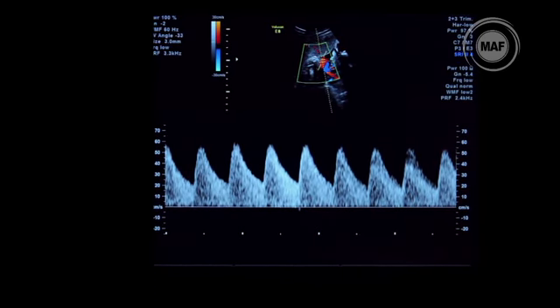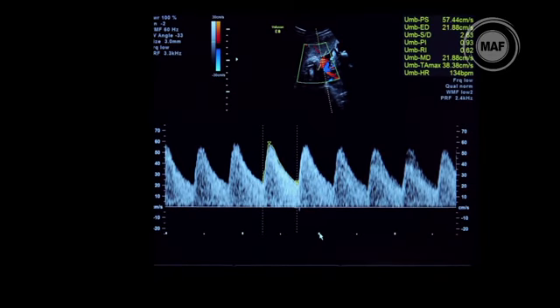Okay, you take the best peak and you can then gradually draw around it, and that's manual. Okay, and the measurements, you can get the measurements up here. It's PI and RI. Okay, the umbilical artery, and what we're looking for is that this is called the end diastolic part of the flow, that this is present.